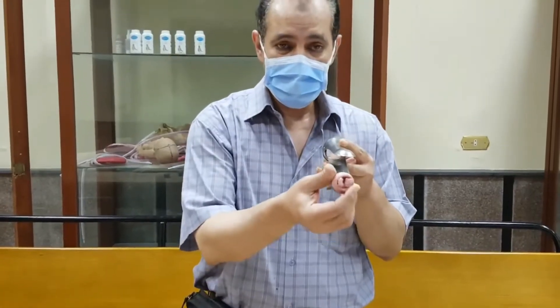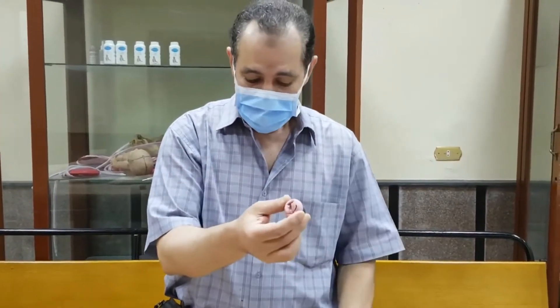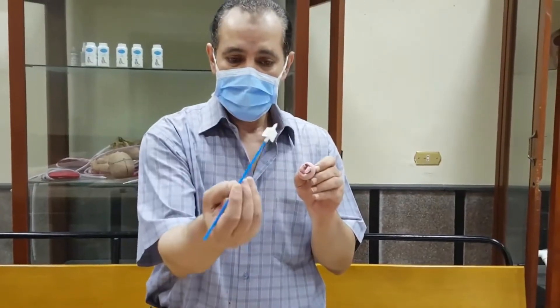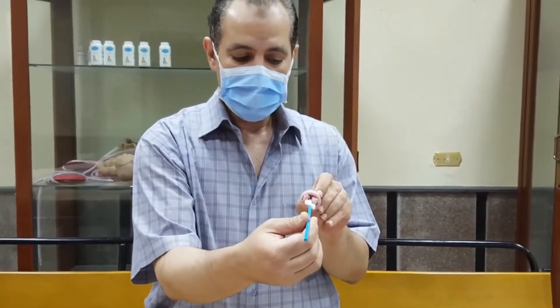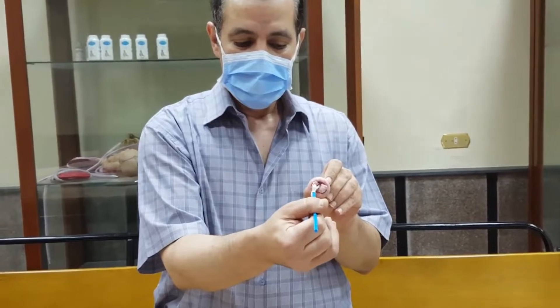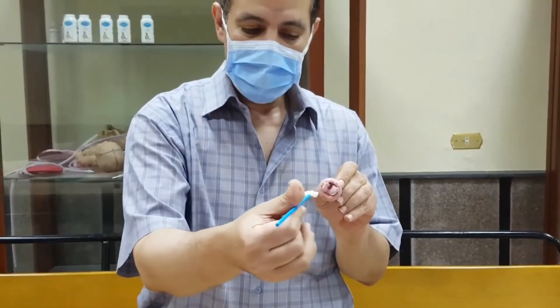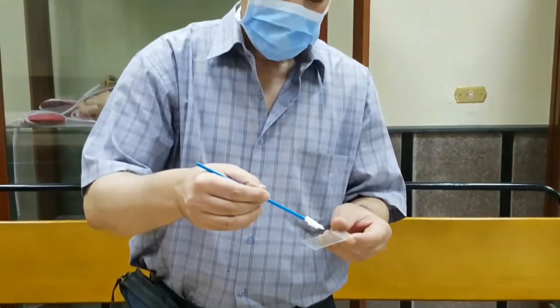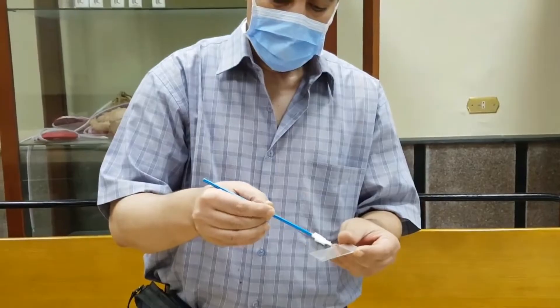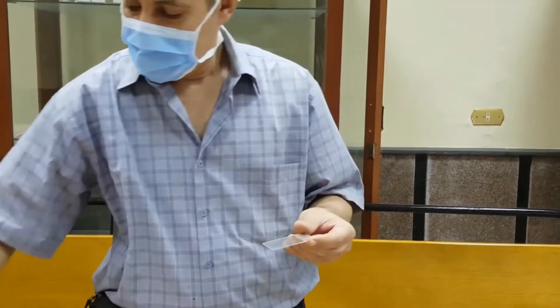I can see right now the cervix; this part appears in front of me. I fix the speculum in this area, then I use a cytobrush. This tool is called a cytobrush. I insert it in the external os like that, then rotate 360 degrees — or another 360 degrees — then remove it without touching anything, then spread it on the slide like that. You spread it on the slide like that, then fix with the spray like that.